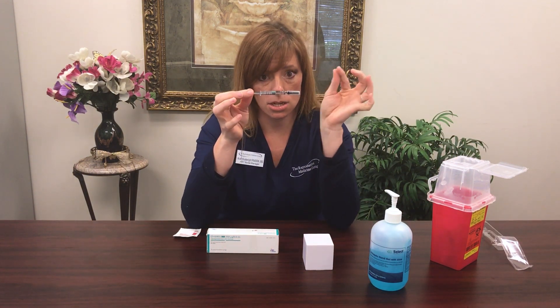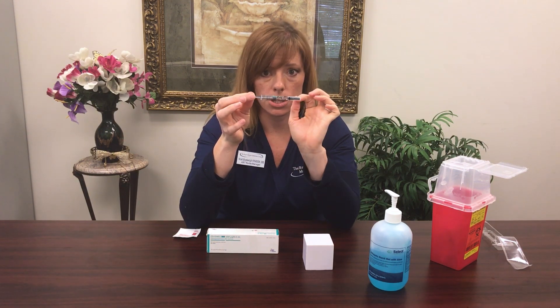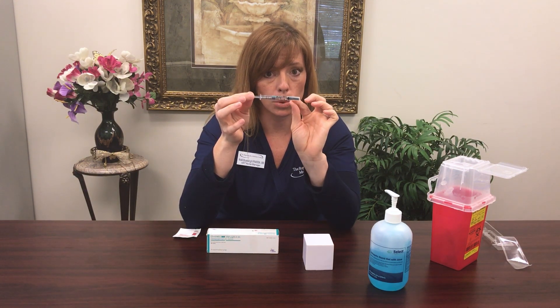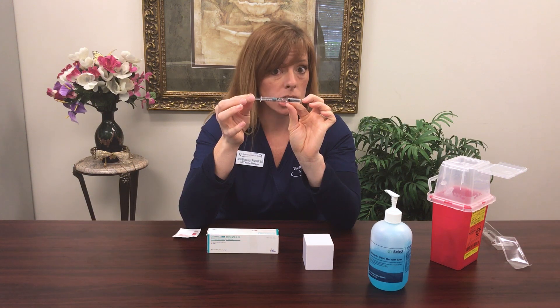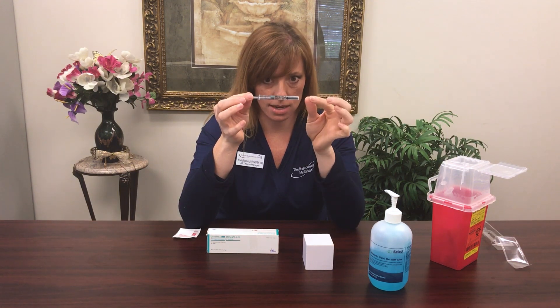You'll see in your syringe there is an air bubble. That is by design — I do not want you to worry about getting the air bubble out. The air bubble will actually help you to push the medicine into your skin further. So everything is perfect the way that it is.